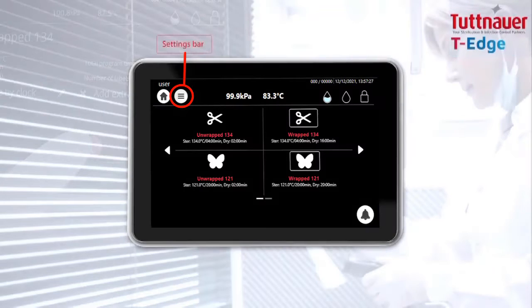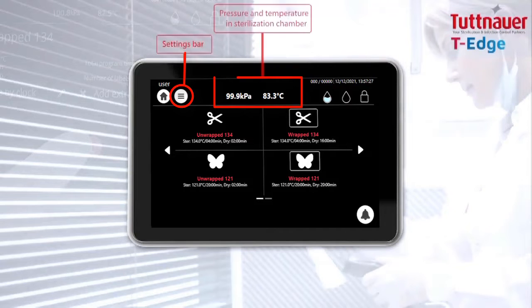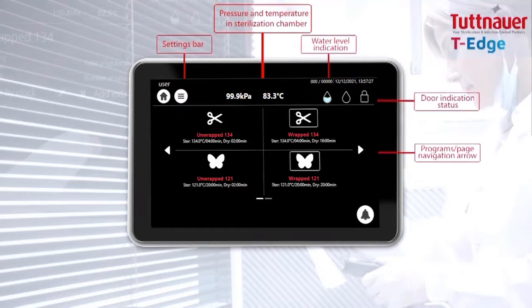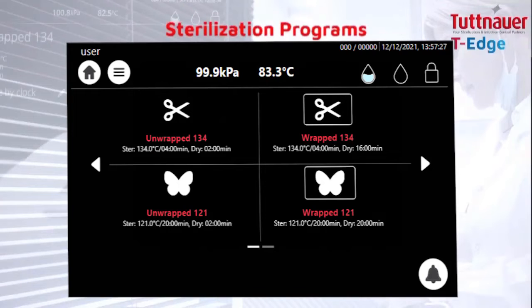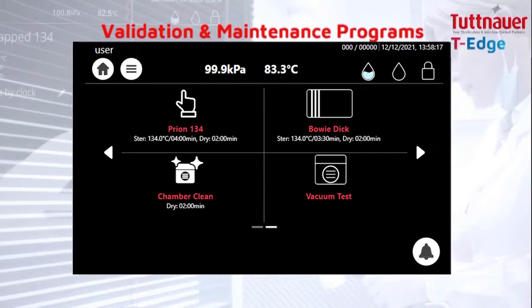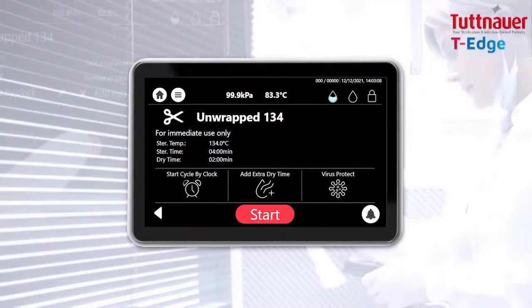Meet our friendly user interface touch screen. Based on your load, press on the requested sterilization program, or choose from the validation and maintenance programs available. Press start to begin the sterilization cycle.